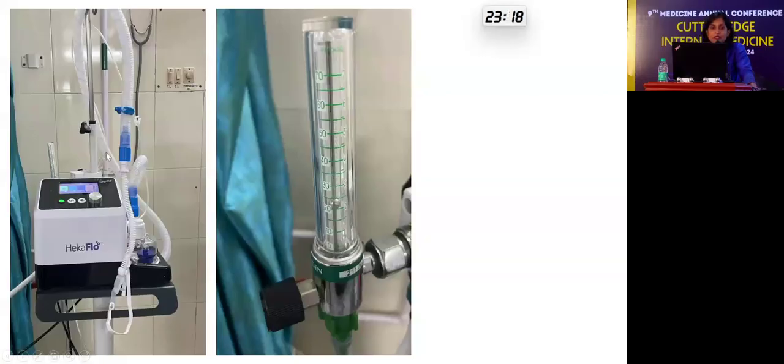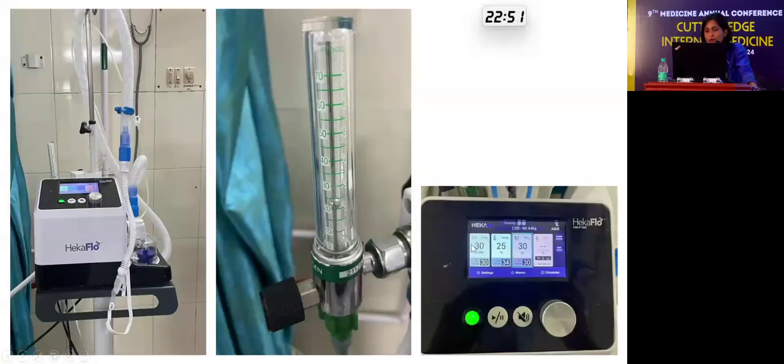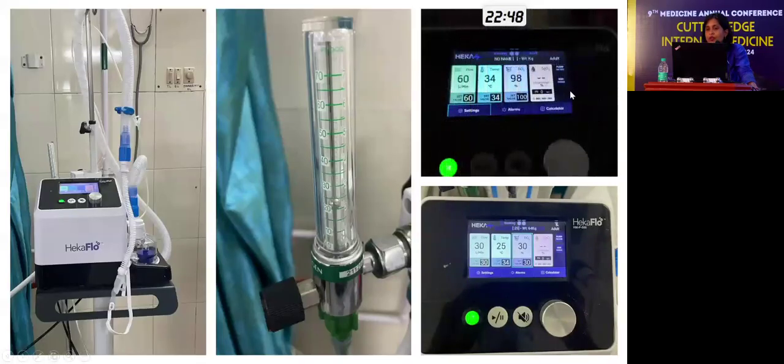So you can see here, it's got one place where you can adjust the settings in terms of the flow and the oxygen. You've got a humidifier, which can deliver humidified oxygen and heat it at a particular temperature. You've got a tubing with a heated coil inside, and you've got the nasal cannulae, which are sitting here with an adjustable head strap. And here you can see the flow rate can go anywhere up to 70 liters per minute. And this is just a picture to show how you can go up from 30 liters per minute, 30% FiO2, all the way to 60 liters per minute, 100% FiO2 with the high flow nasal cannula. So you can actually give the patient an increased amount of flow.